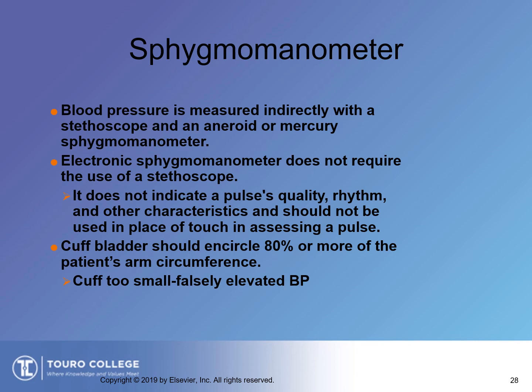Because if you're using too small a cuff, I've had it be quite striking, actually, that their blood pressure is so much higher than it actually is by using the wrong cuff. So always try another cuff. In my setting, if a patient has an elevated blood pressure, if it's super high, like 220 over 130, I'm going to advise them to go to the emergency department for evaluation. But I just don't say, oh my gosh, your blood pressure is too high, you need to go to the ED. I will do both arms. I'll have them sit in a chair with their feet on the ground, not crossed. I will have their arm level with their heart.